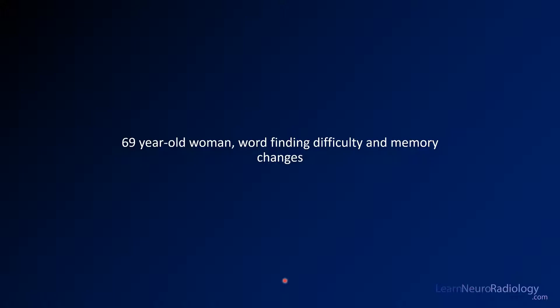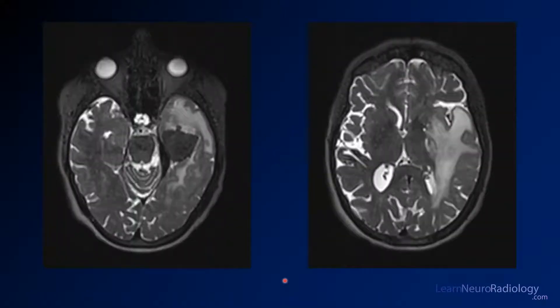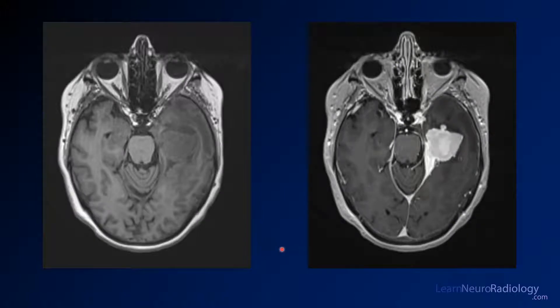Moving on to a 69-year-old woman with word-finding difficulty and memory changes. T2 images through the tentorium show a little thickening of the left tentorium and a very low T2 mass extending into the middle cranial fossa from the medial aspect, with a lot of surrounding edema in the left temporal lobe extending into the insular white matter and basal ganglia. On pre- and post-contrast imaging, there's a relatively isointense mass — similar to gray matter — that enhances very avidly and solidly on post-contrast, with a few pedunculated areas and thickened tentorium that is also enhancing.